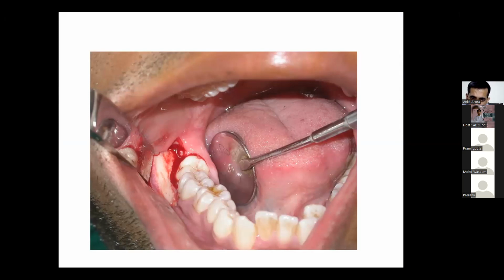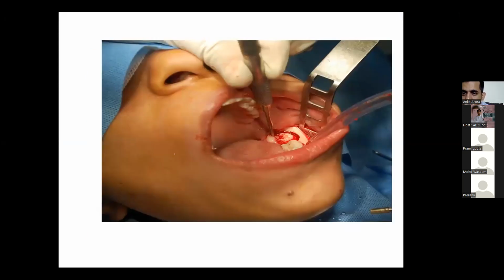Another case where you can see it here. In fact, the blood pooling in itself is an indicator of how you are going to do the buccal cutting and where the blood pool will happen. Okay, this is how it looks like.